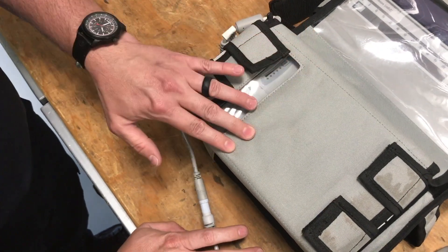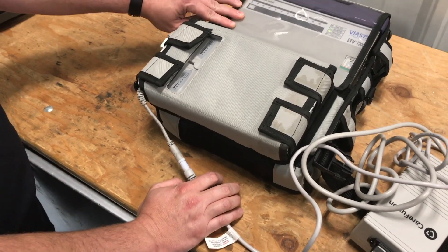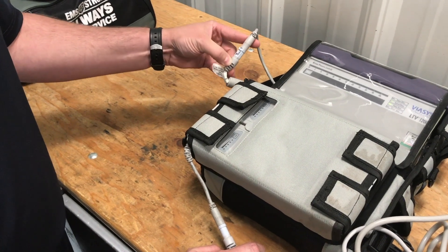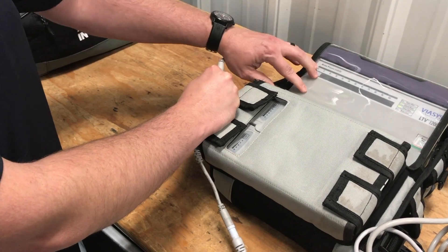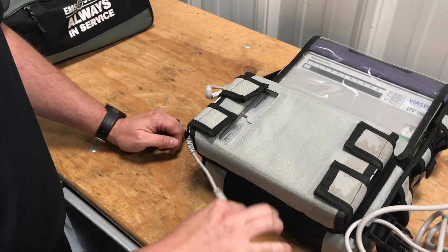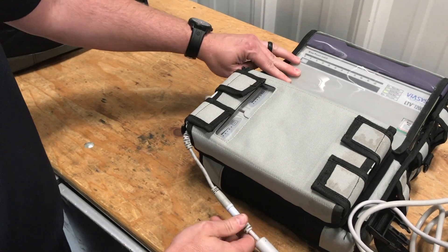Once these two are charged it will also charge the internal battery pack in the LTV 1200 itself. On the side of the vent there's another connection — we don't ever want to charge from that connection, because doing so will only charge the internal battery and not the two auxiliary batteries. By plugging into the lower port we charge both the two external batteries and the internal battery.